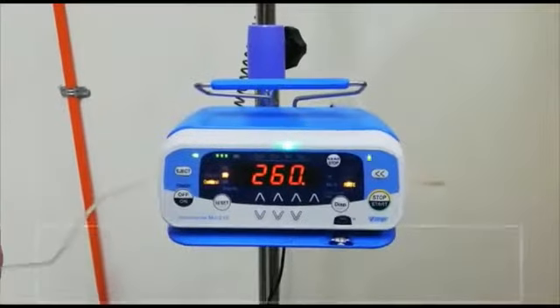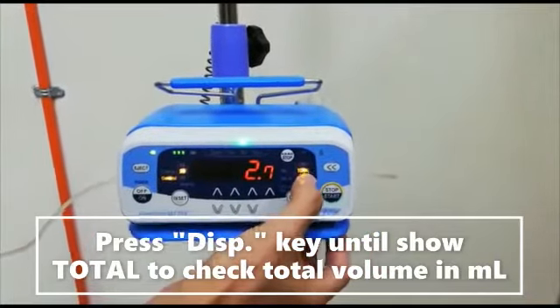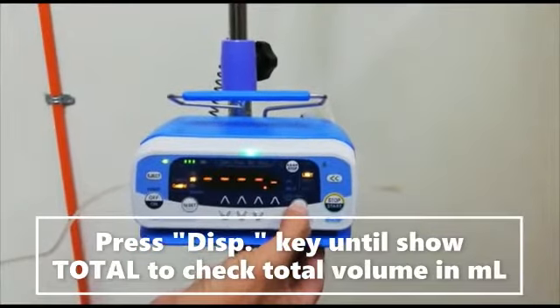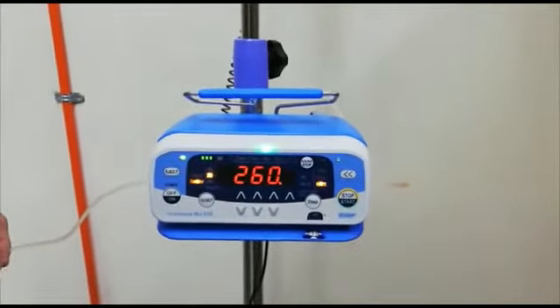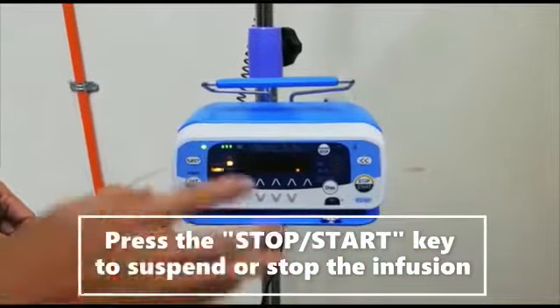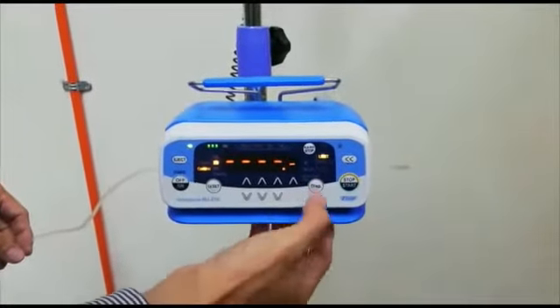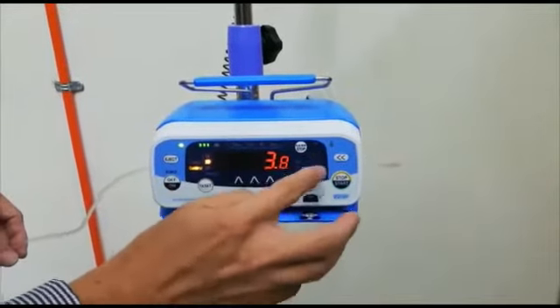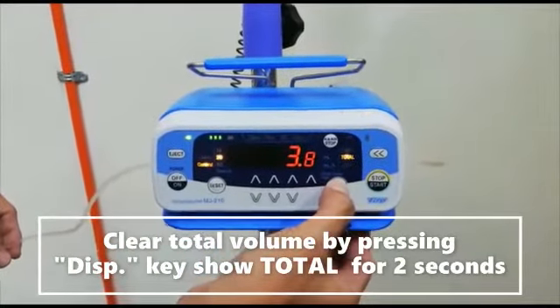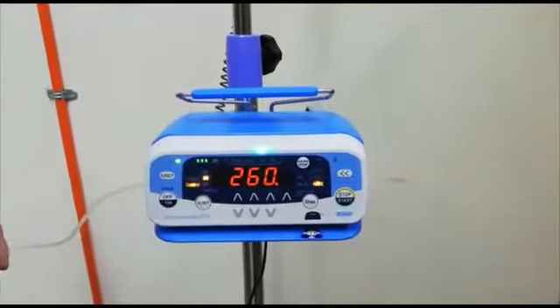During the infusion, if you want to check the total volume, you press the display here. This is the indication we mentioned, total volume. It already shows 2.9 mil, about 3 mil, into the patient. So this is how you check the total volume. If you want to suspend the infusion, you just press here. Then this blinks, so the pump is now suspended. At this stage, you can change the rate and set the volume limit. To clear the total volume, while the total is blinking, you press here for two seconds. The total volume disappears. Then you start again. Now the pump is in operation again.